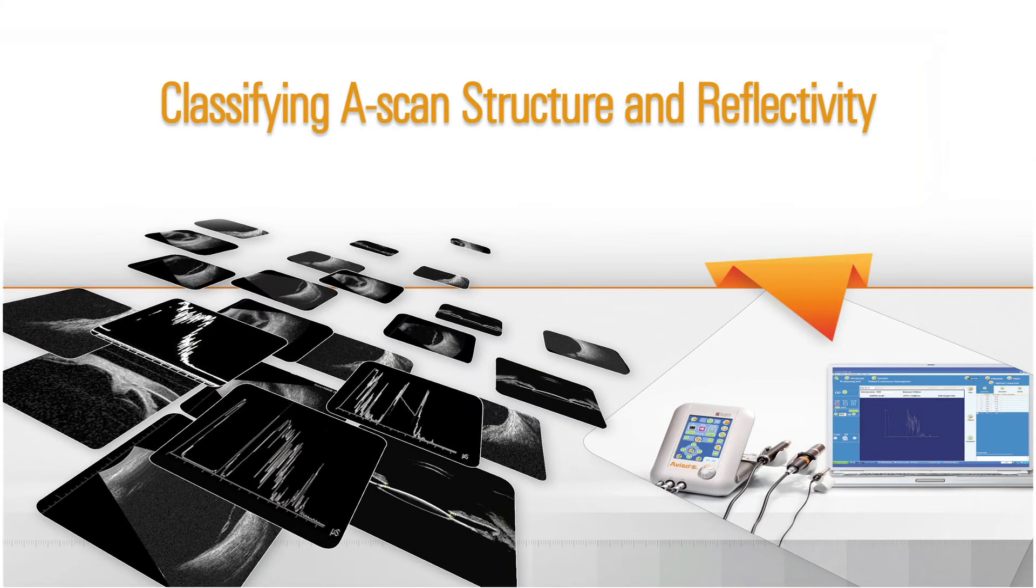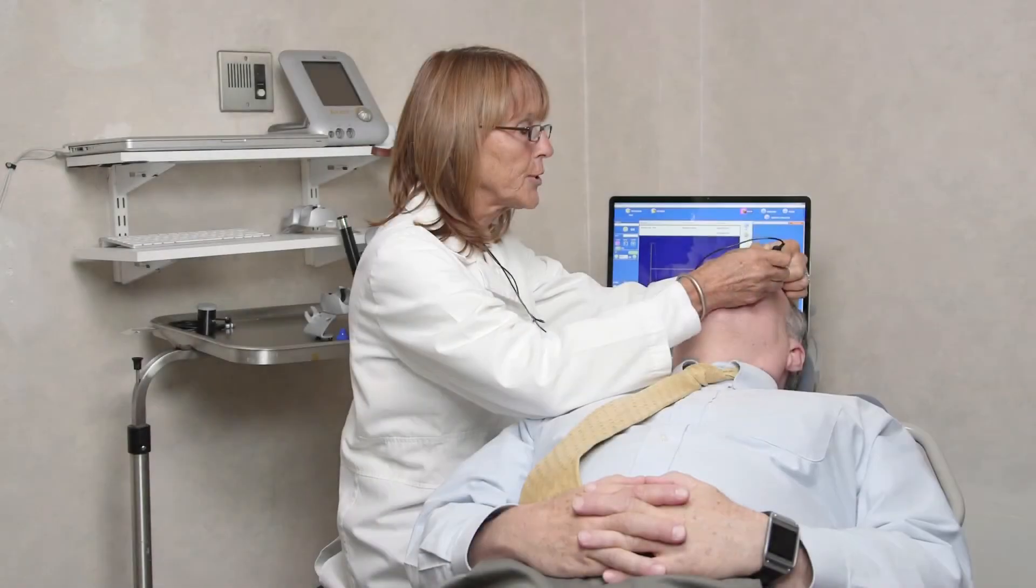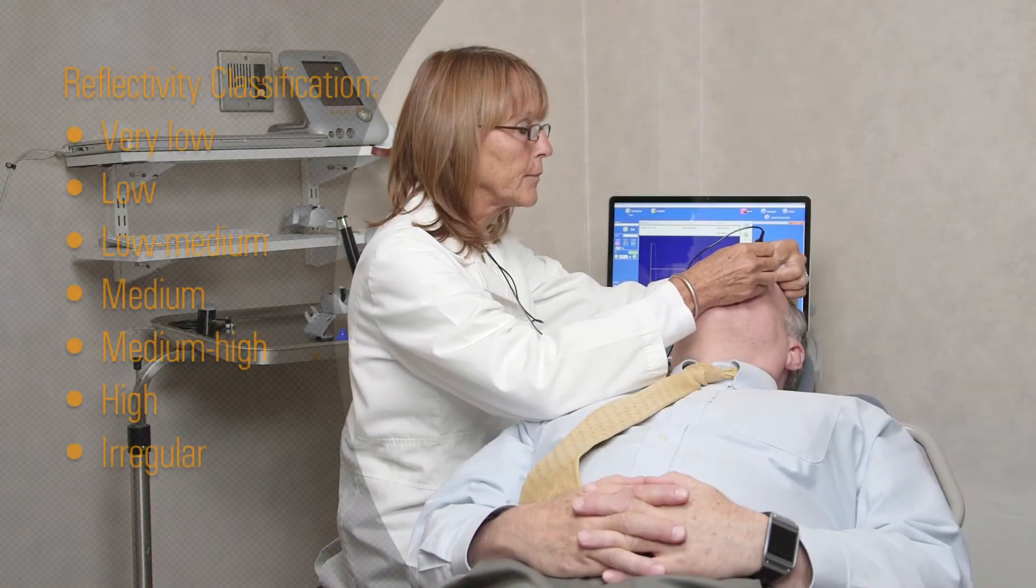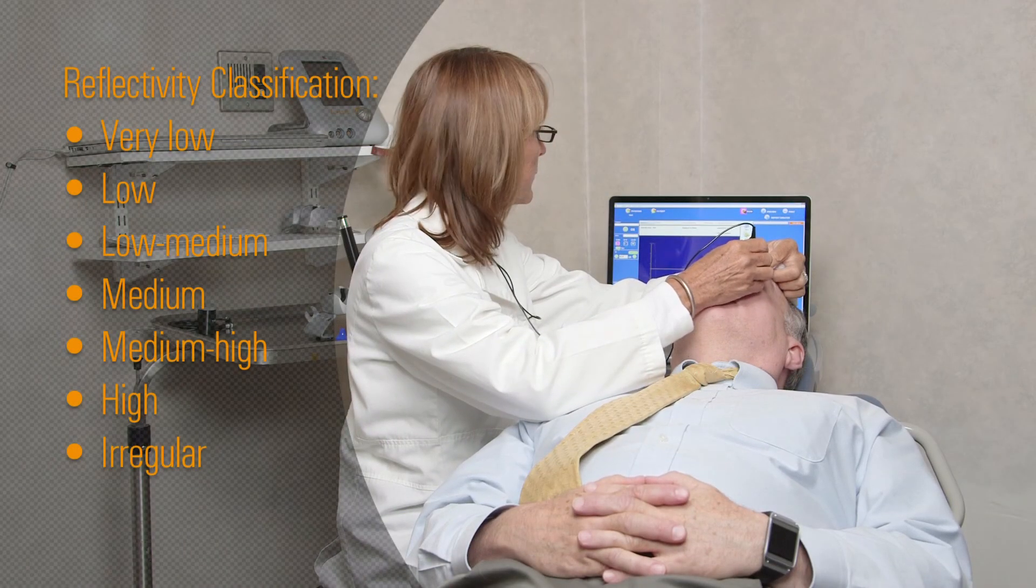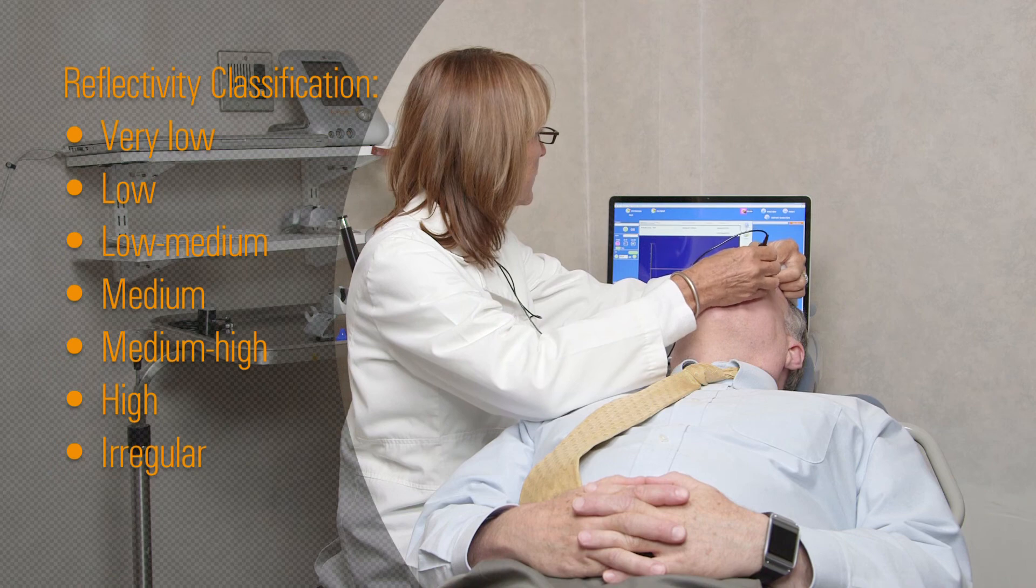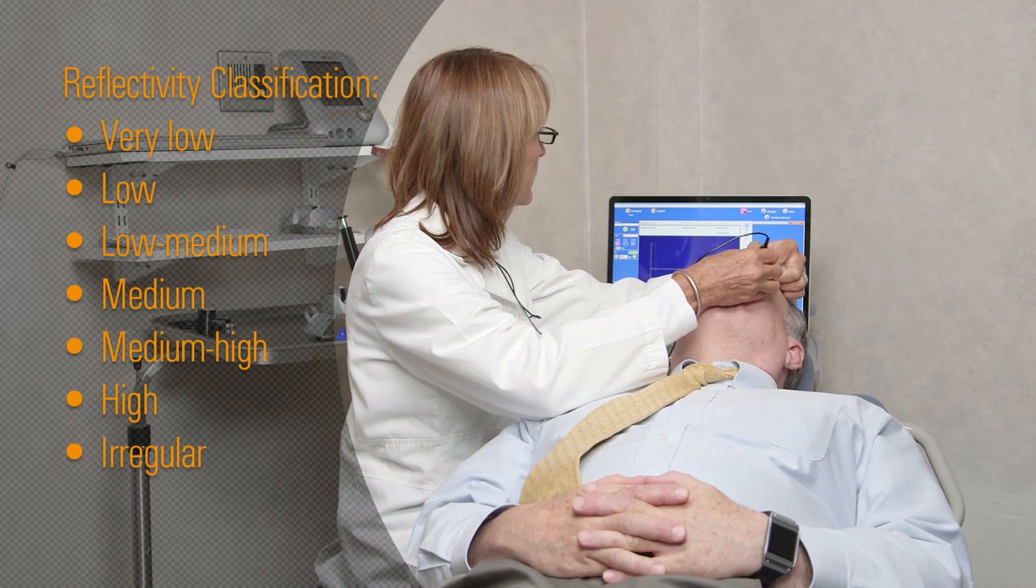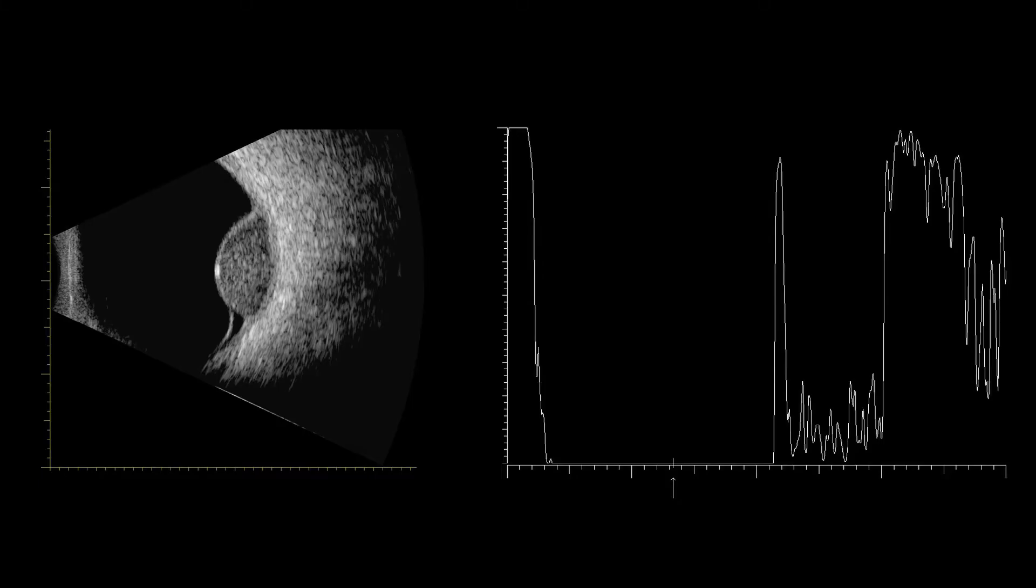Classifying A-scan Structure and Reflectivity. Reflectivity is classified from very low to high and can be regular or irregular. A mass composed of uniformly sized, regularly positioned and densely packed cells, such as a choroidal melanoma, will likely allow the passage of sound with minimal reflection back to the probe.